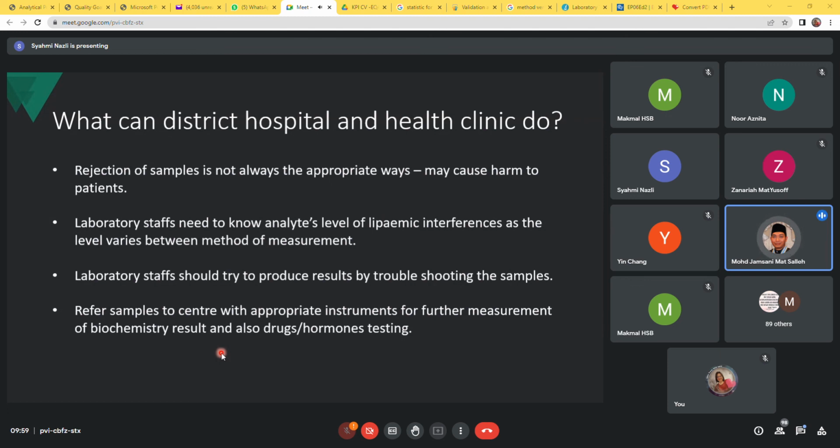So untuk lipid profile, kita tak akan analisa ujian selepas daripada high speed centrifugation. Jadi di mana-mana hospital tu dia kena buat that lipid profile supaya the high lipid profile tu akan warrant that this patient actually possibility to have familial hyper-TG, for example, in this kind of patient.